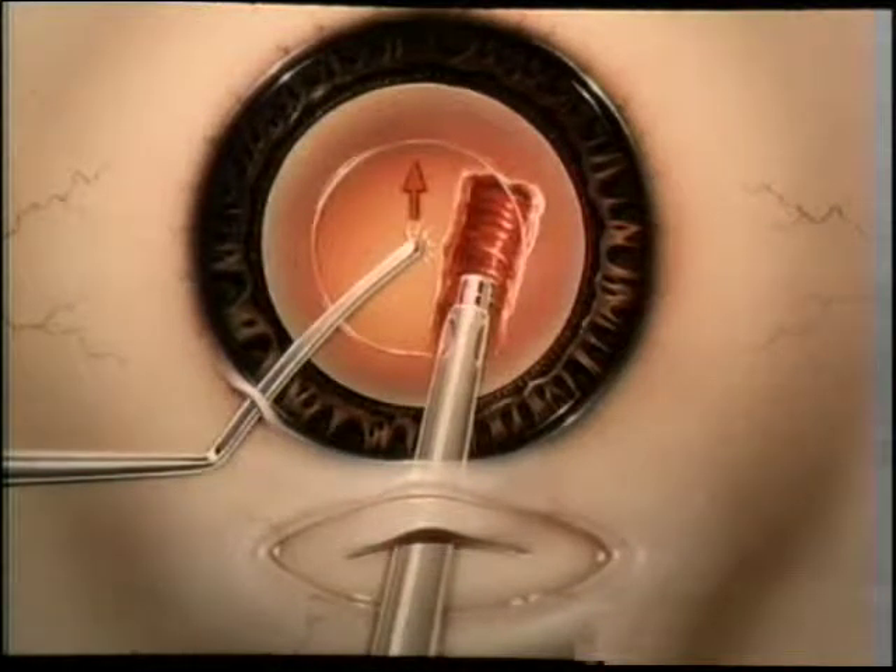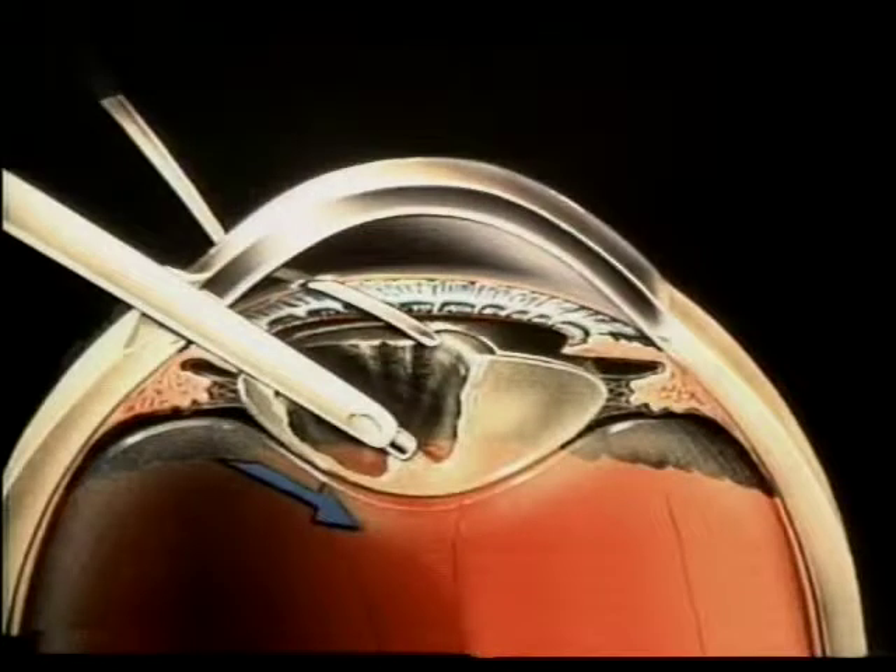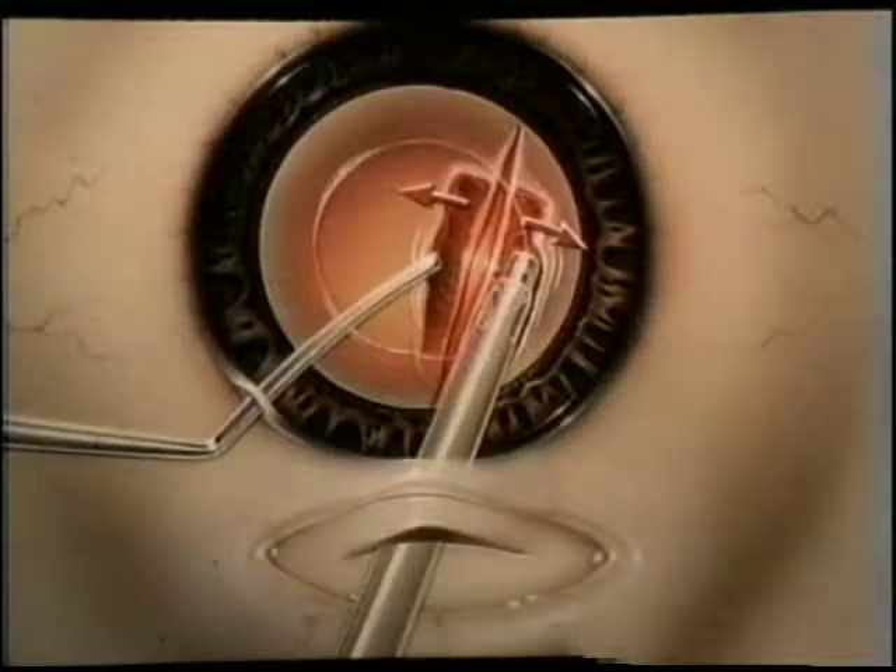The technique begins with a shallow trench or trough sculpted slightly to the right of and just past the center of the lens nucleus. The lens is stabilized with the second instrument. Further sculpting of the upper portion of the lens can be accomplished at this point or after the first fracture. Nudging the loosened lens inferiorly with the second instrument, down-slope sculpting is accomplished, going very deeply to the posterior pole of the lens.